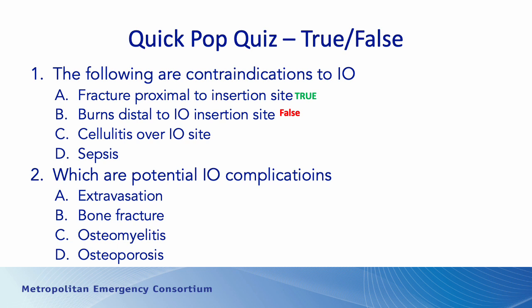How about cellulitis over the IO site? That's an absolute true statement. You should not be using an area that's got cellulitis to place your needle. You don't want to drill through infected skin. So if the leg is cellulitic, find a different site.